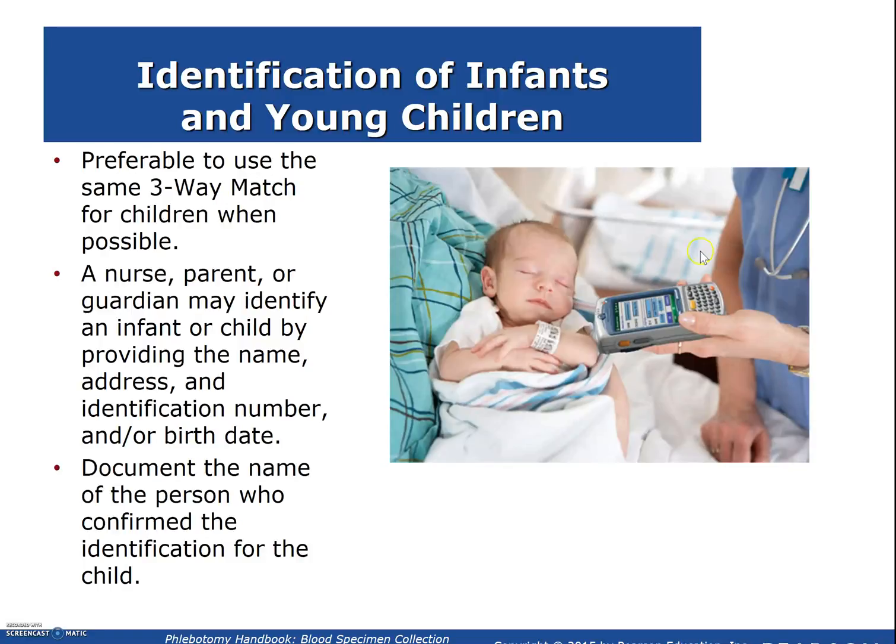And we have new systems now where there is a scanning feature that scans the bracelet and that goes into our system. So that's another way we triple check for children and adults as well.